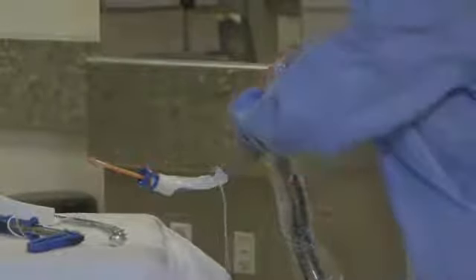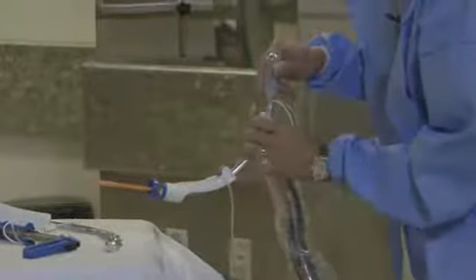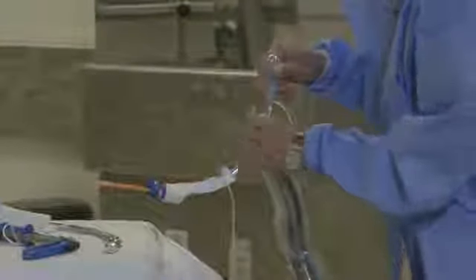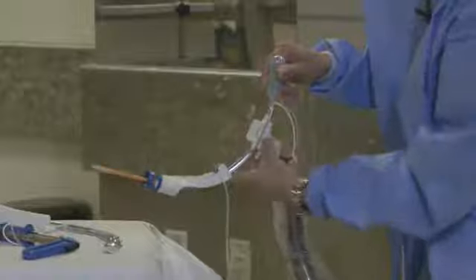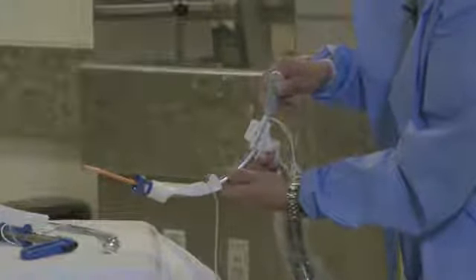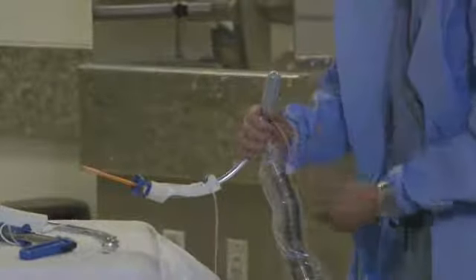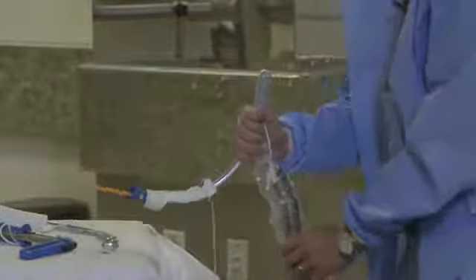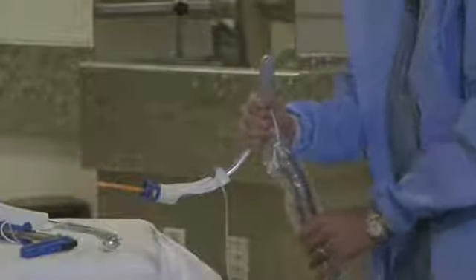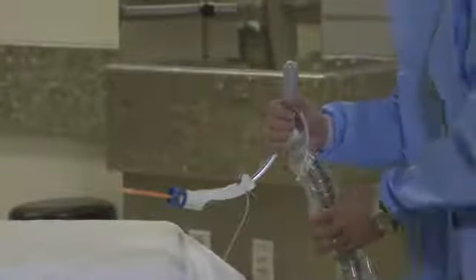If you don't have it in the proper location, let's say we have it this way, and you try to close it, it's not going to clamp down. So again, you want to make sure, first of all, it's oriented in the proper location. You're going to feel that thing sit correctly in the appropriate groove, and then you're going to be able to lock it, okay? And then once it's in place, you can go ahead and manipulate it. Now, one thing that I want to point out to you, and I'm going to move these other manipulators out of the way, is that when you do make your subtle adjustments, you want to actually use two hands.